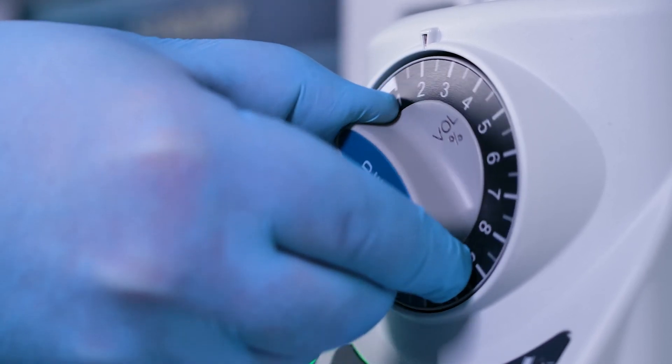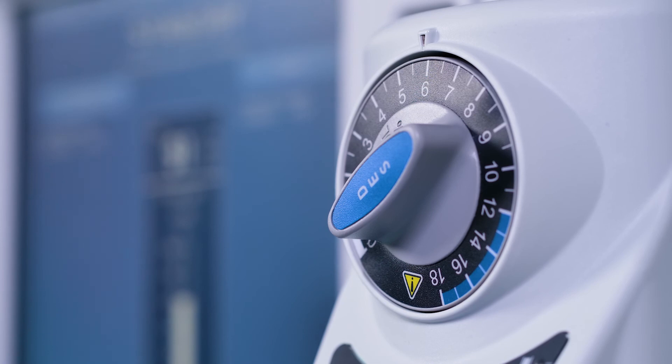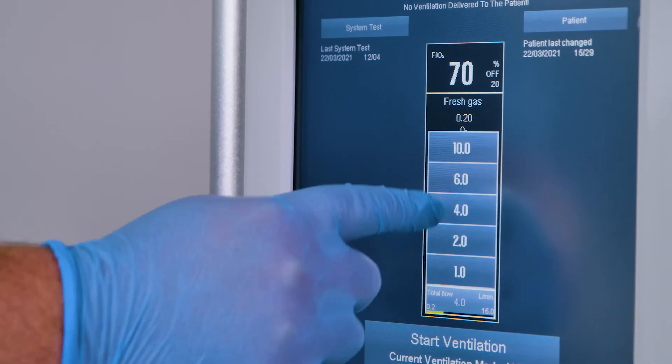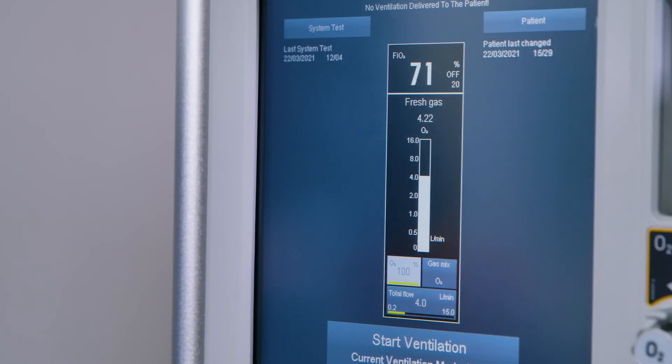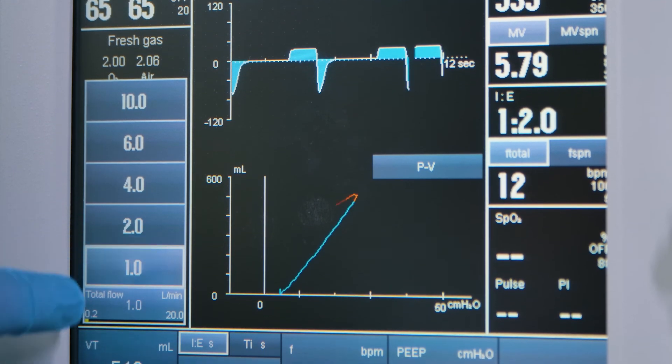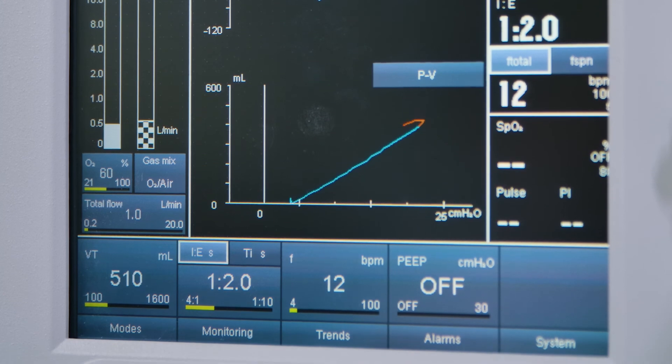A fully charged battery will power the vaporizer for a minimum of 5 minutes at a set concentration of 6% and a fresh gas flow of 4 litres per minute. At higher settings, the backup period may be shortened. The backup period may extend to a maximum of 30 minutes, depending on the fresh gas flow rate and concentration setting.